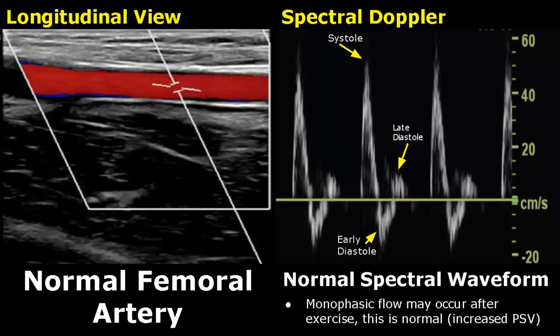Monophasic flow may occur after exercise, where the waveform will only show forward flow. This is normal. After resting, it will eventually return to the normal triphasic waveform.